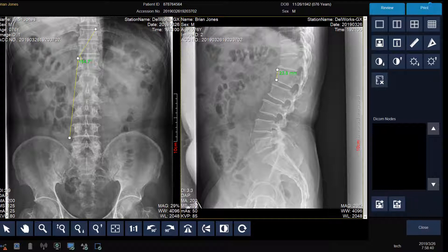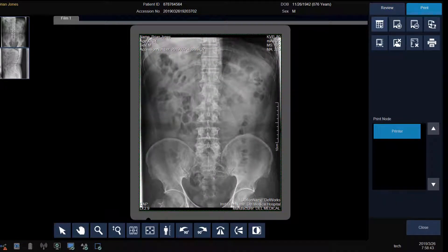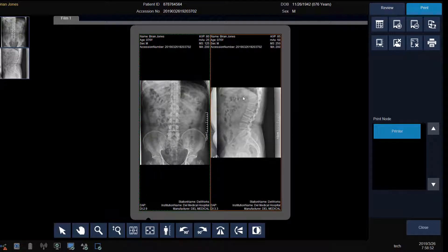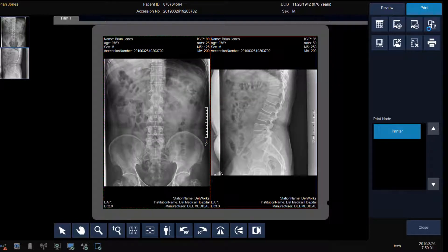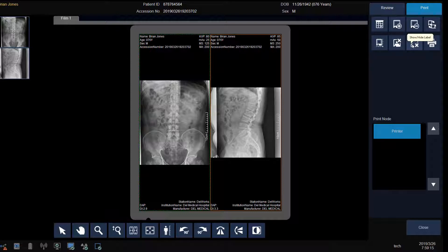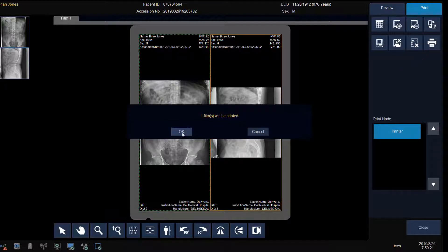We can also print images from this screen by selecting the Print tab, defining the film layout, adding a film, deleting a film, changing the orientation from portrait to landscape, defining a film size if more than one film size is available, deleting an image, showing or hiding the label, and clicking Print to print the images, then click OK.